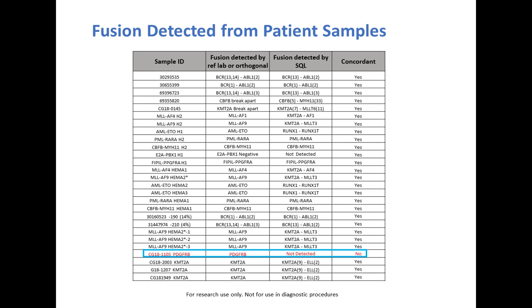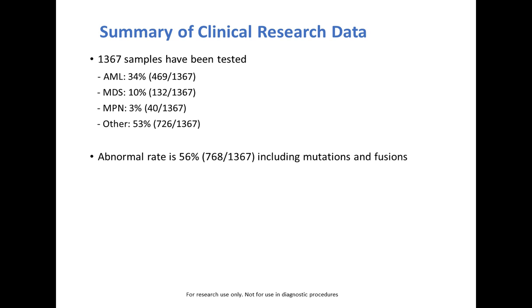So we repeated 2 or 3 times, then we finally figured out the primer for the RT-PCR and the primer for the NGS are different.